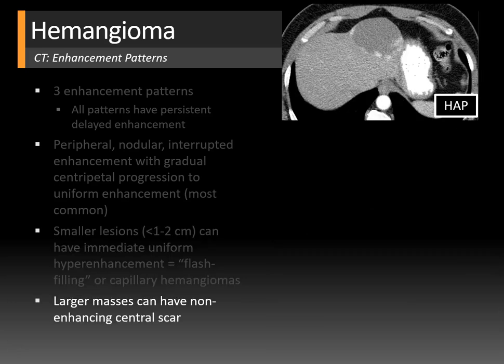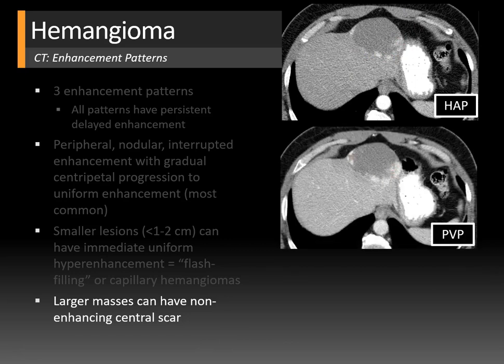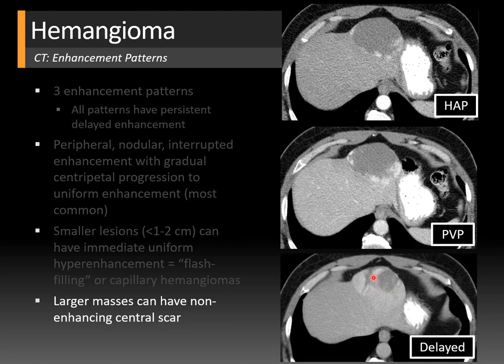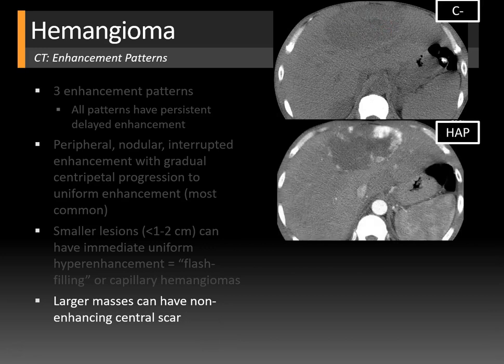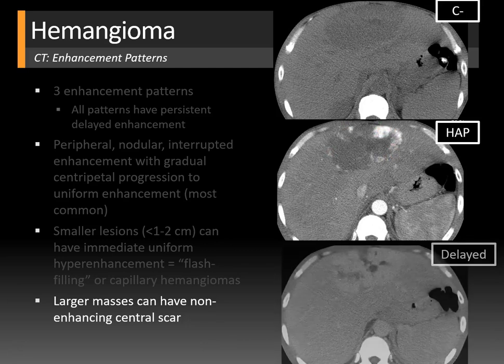The third pattern is seen with larger masses, which can have a non-enhancing central scar. On the hepatic arterial phase, a large hemangioma starts with peripheral nodular enhancement that begins to coalesce centrally on the portal venous phase, but even on delayed phase the center doesn't fully enhance — there is a non-enhancing scar. The scar appears more hypodense relative to the surrounding hemangioma on non-contrast imaging. This is a typical pattern for large hemangiomas.